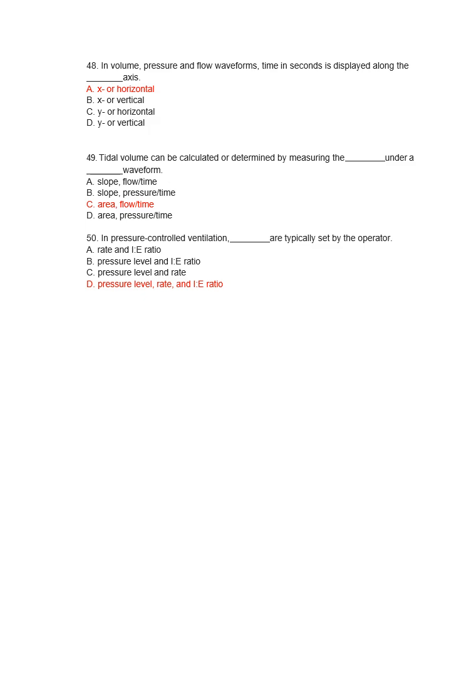In volume, pressure and flow waveforms, the time in seconds is displayed along the horizontal axis, or the x-axis. The pressure, volume or flow is displayed along the y-axis, or the vertical axis.